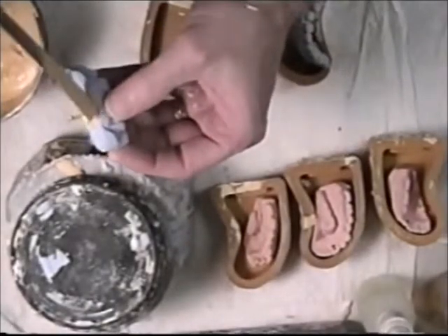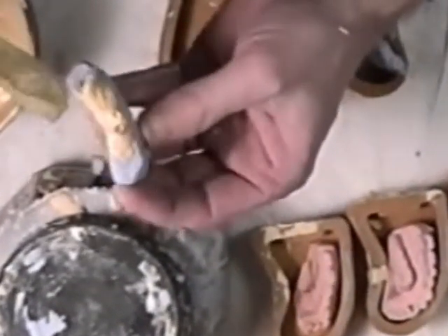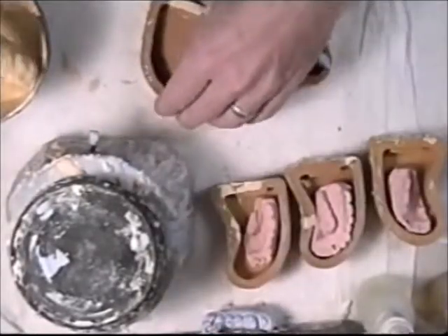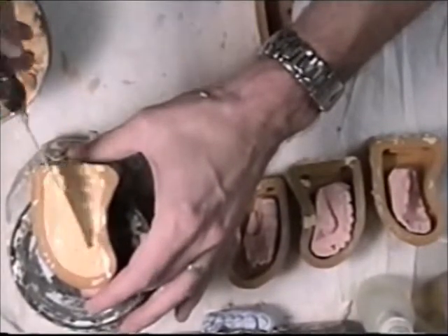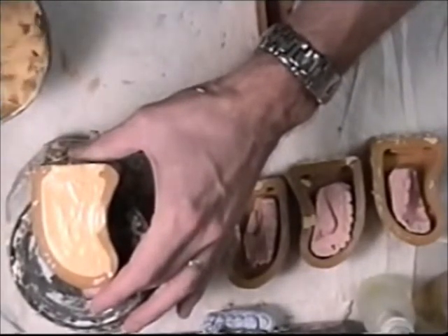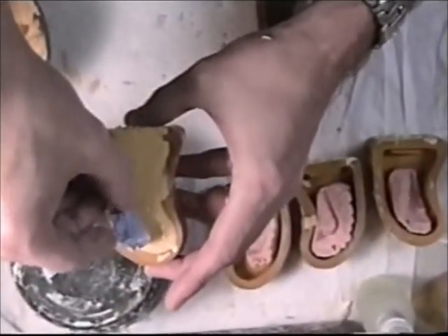Just repeat what I've done here on this model. Don't want to put too much into the mold, or it will create an undercut.